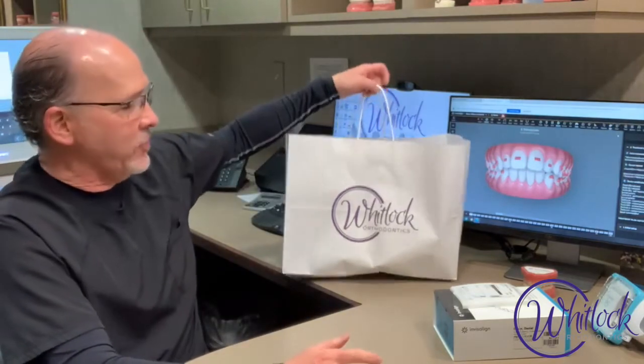Dr. Whitlock here, and I'm so excited that you're getting started on your journey to getting your rockstar smile. I want to go over a few things that you got in your Whitlock on the go take-home kit. So this lovely bag here you got.